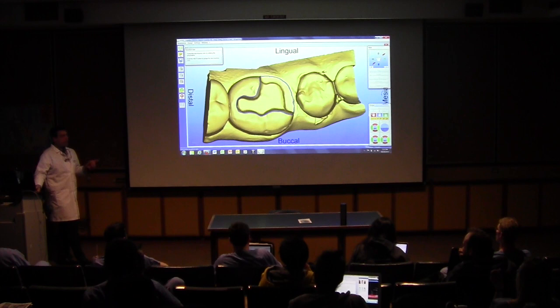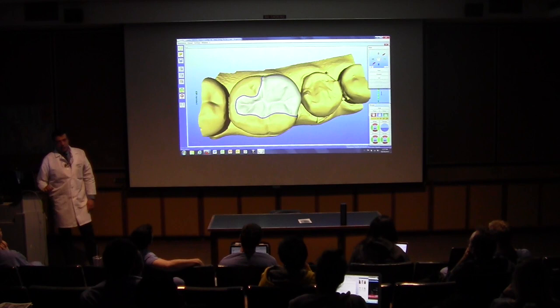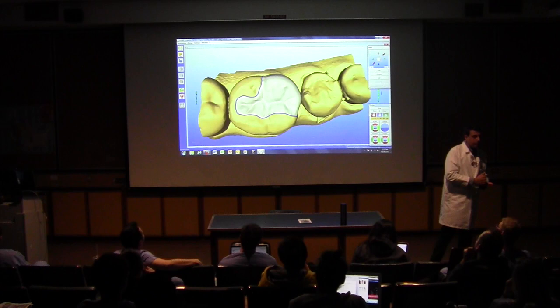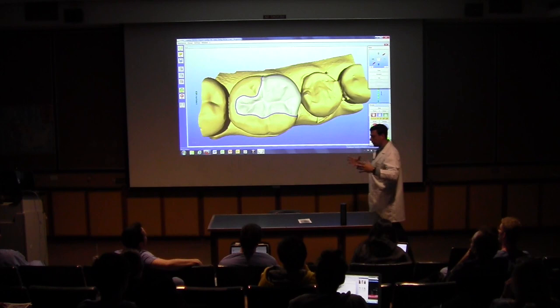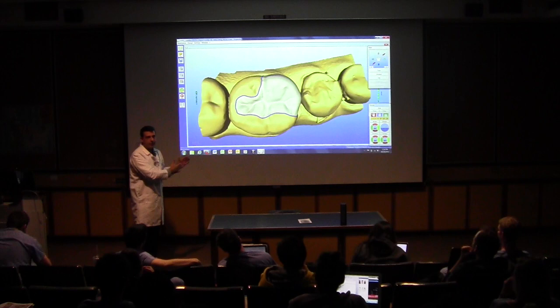If you hit next, pay attention to what's going to happen. The software now is trying to fit in that particular spot more than 400 different restorations. Also, the software is getting information from the adjacent teeth in terms of the occlusal anatomy here, central fossa. The software is also calculating the distance from the adjacent mesial tooth, and in a complex case, it is also getting information from the opposing teeth. You see how complex it is? For you, it's just a matter of seconds to have an onlay restoration done.